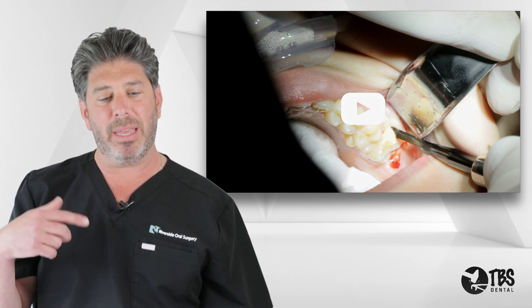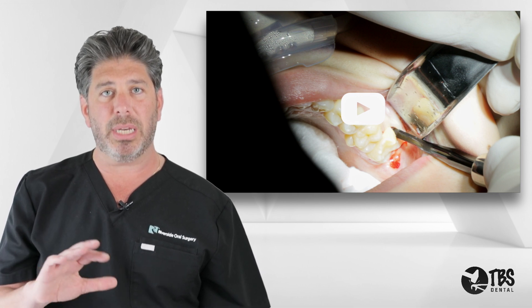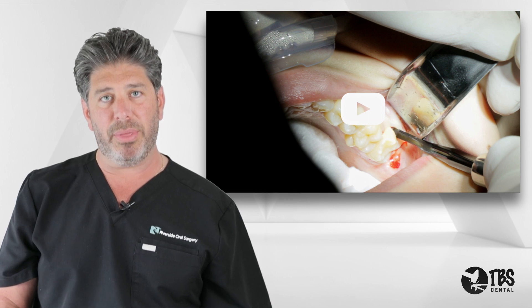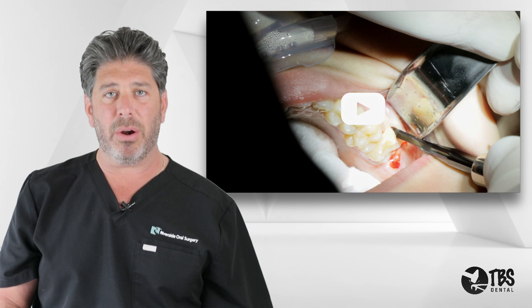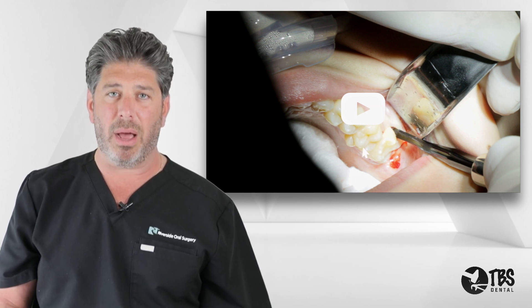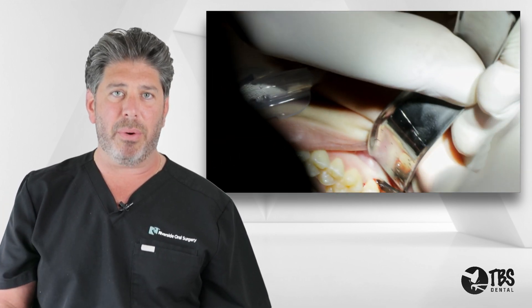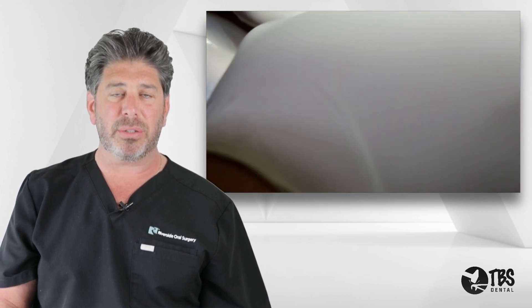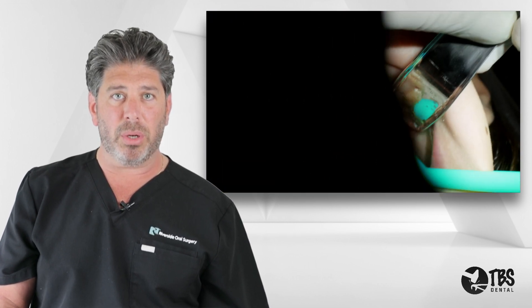I move to extracting the upper third molar first. Typically, as long as there's no significant bone or soft tissue — which I would remove with a rongeur — I will use my 77r elevator, positioned right at the cervical margin of the distal of the second molar, using slight rotation and downward force, always using less force than you would think is necessary, just fingertips. We then remove the upper third molar.